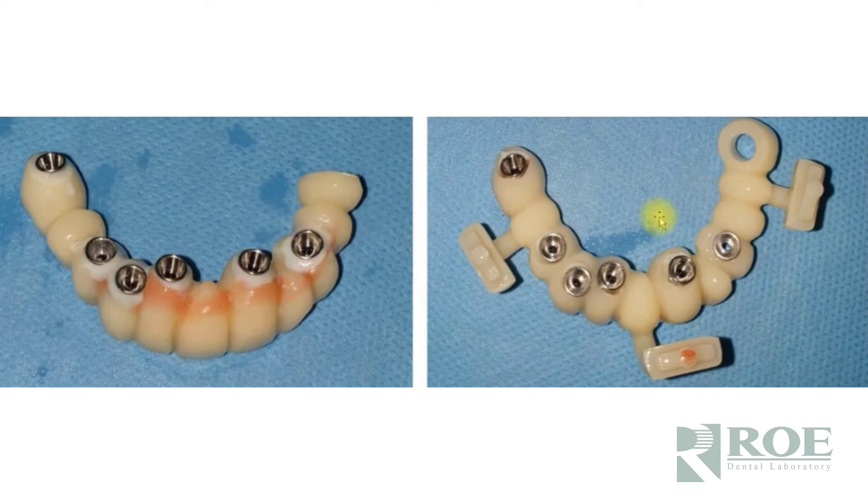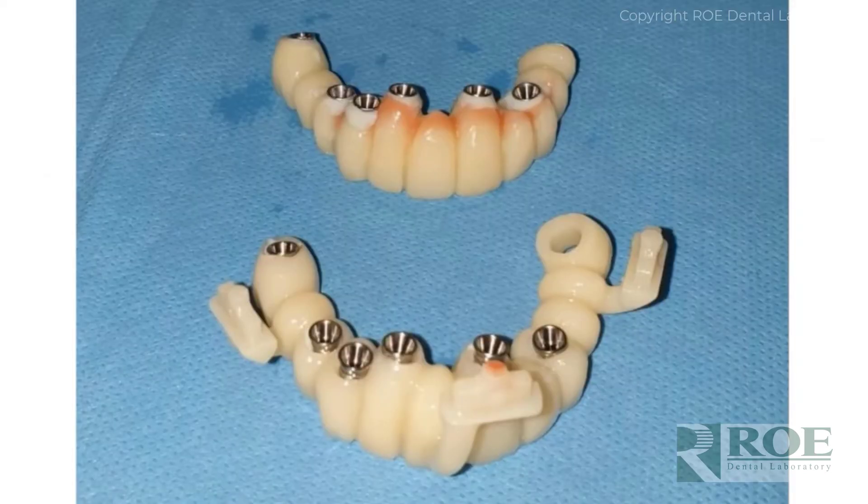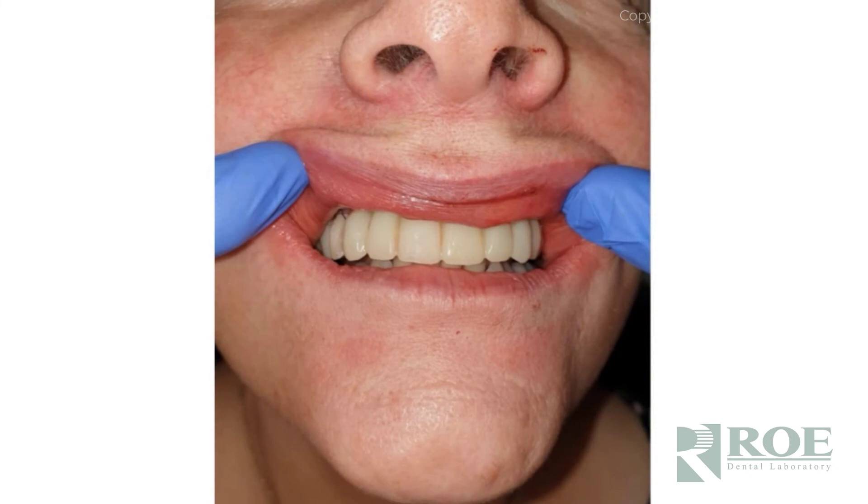In six months, just put a temporary cylinder on that implant and pick it up. Then send us a soft tissue impression, a bite, and the opposing, and we make a prototype for the final. It really can't be simpler — the patient gets to go home with their prosthetic and we have an exact duplicate. The day-of-surgery result looks really nice — just a lovely smile.